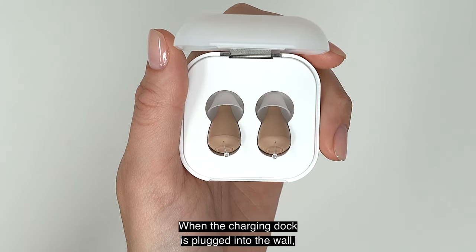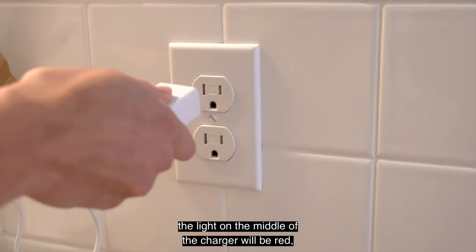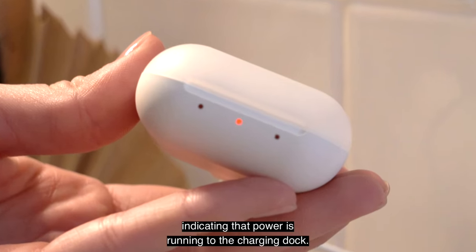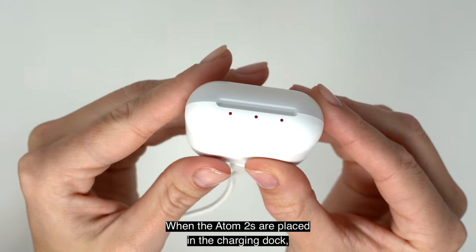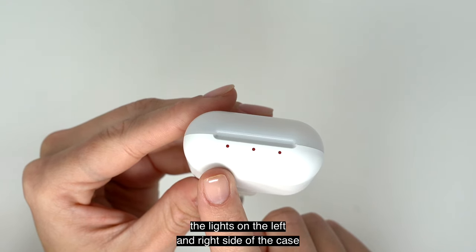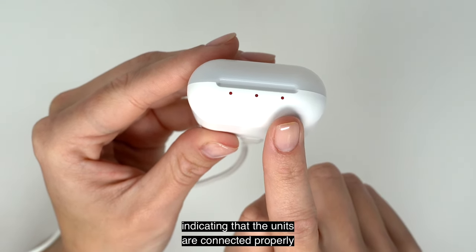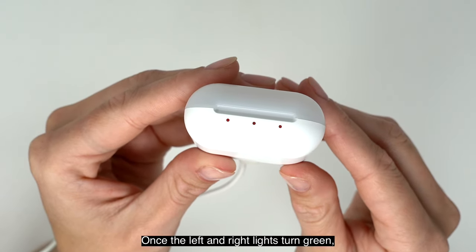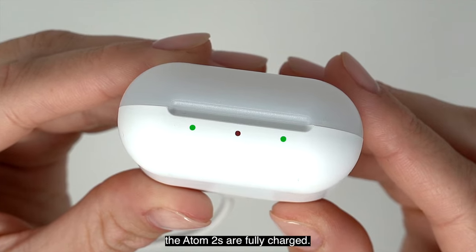When the charging dock is plugged into the wall, the light on the middle of the charger will be red, indicating that power is running to the charging dock. When the Atom 2s are placed in the charging dock, the lights on the left and right side of the case will turn red, indicating that the units are connected properly and charging. Once the left and right lights turn green, the Atom 2s are fully charged.